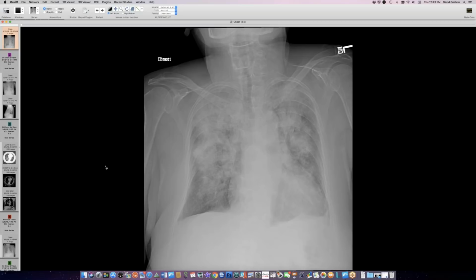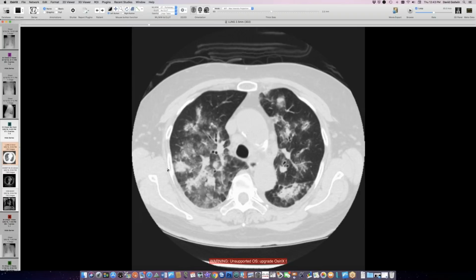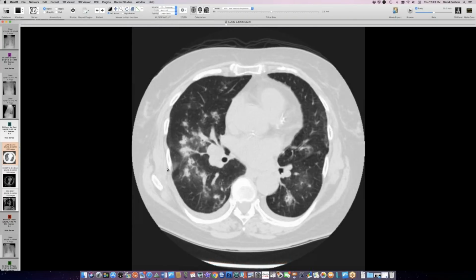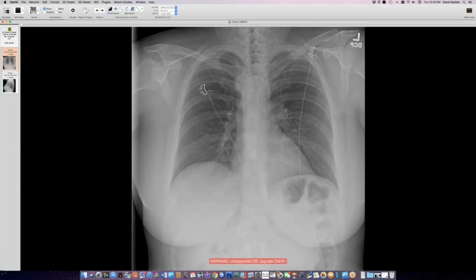It's a hard diagnosis to make, but as soon as you said asthma and showed this, that was the first thing I thought about, because it kind of looks like an eosinophilic pneumonia or alveolar hemorrhage when they get lumped. I think the CT findings fit hemorrhage better than eosinophilic pneumonia. Agreed, in terms of it not being particularly peripheral or basal predominant. And she had both. Okay.